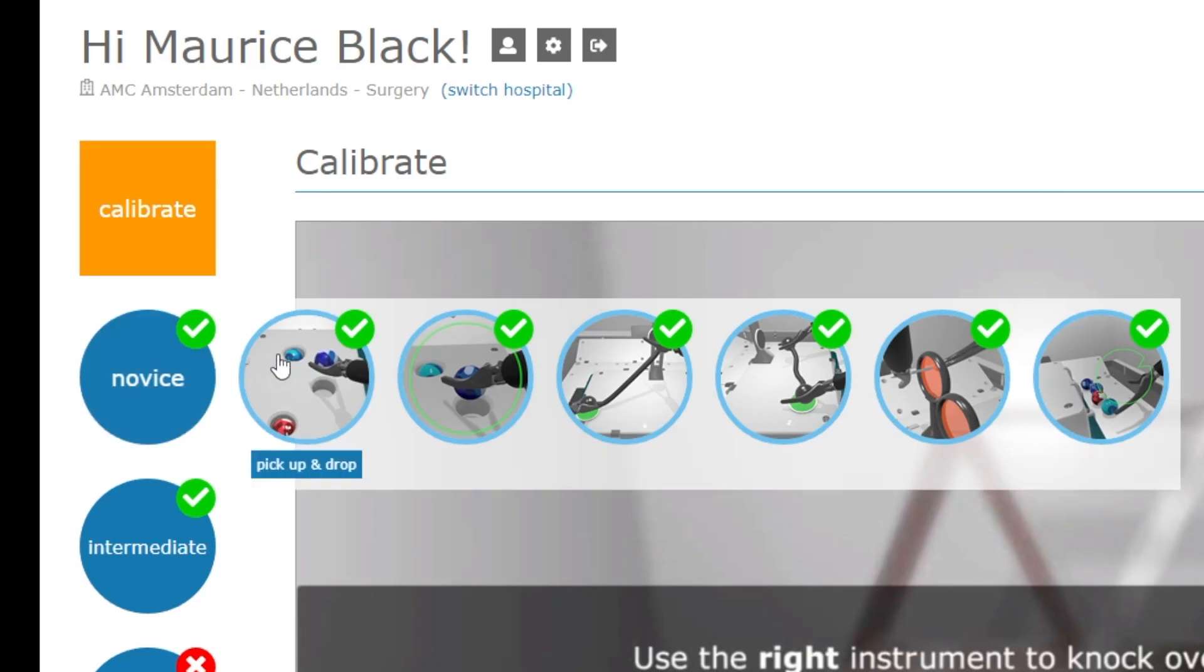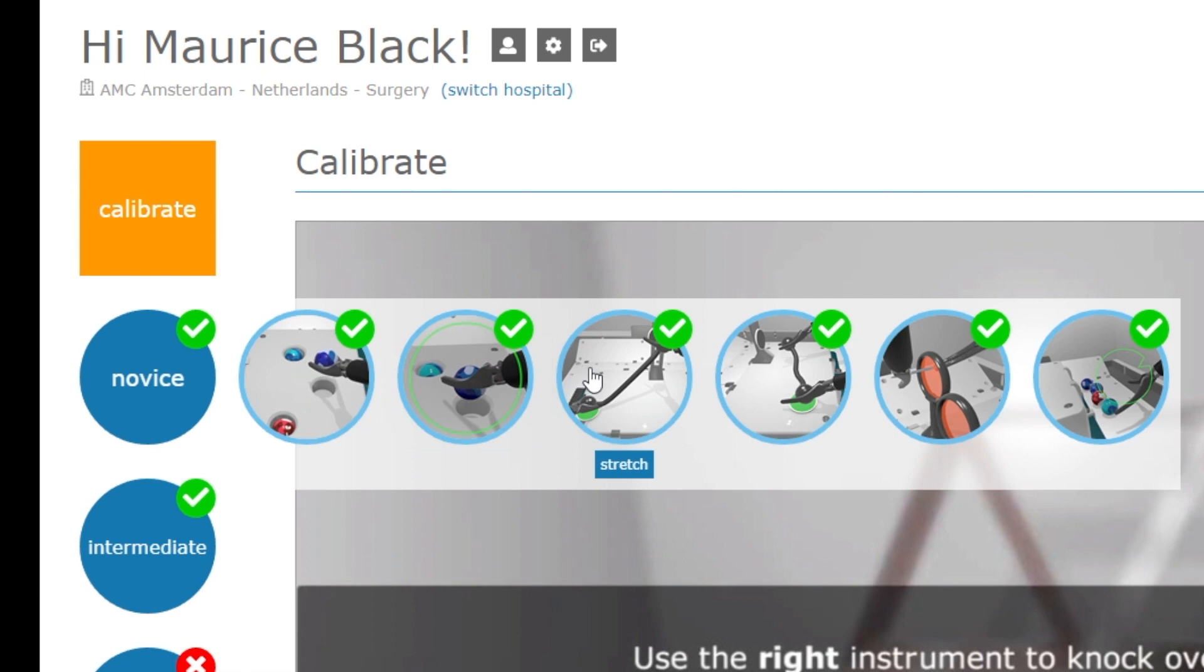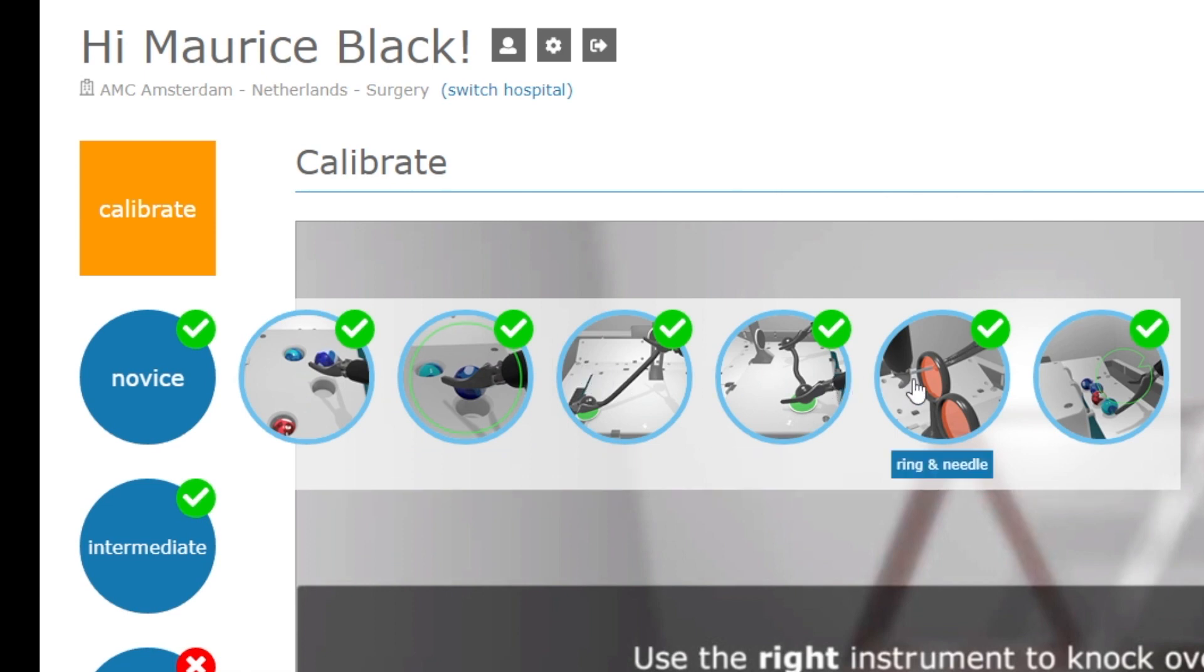These are the simpler ones for novices. They focus on basic coordination and camera targeting.